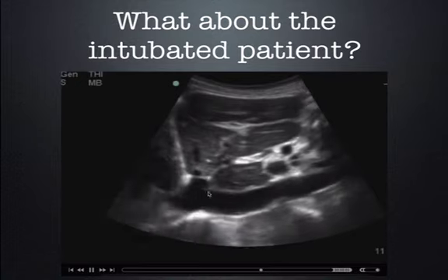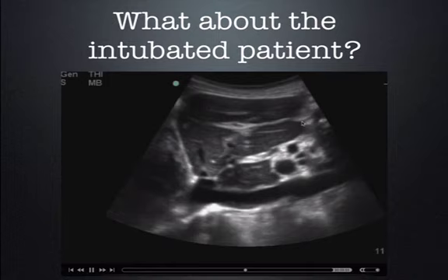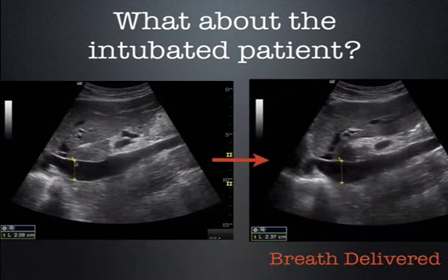At exhalation, the IVC is at its largest diameter. Here the patient takes a breath in, the diaphragm and the liver go down towards the feet, narrowing the IVC. In the case of positive pressure ventilation, the IVC is at its smallest diameter at exhalation. As a positive pressure breath is delivered, the liver and diaphragm descend down just as if you were breathing spontaneously, but that positive pressure here provides an impedance to forward flow. It's actually going to dilate the IVC. So effectively, your physiology is reversed.